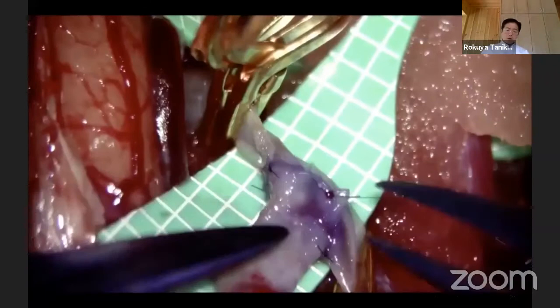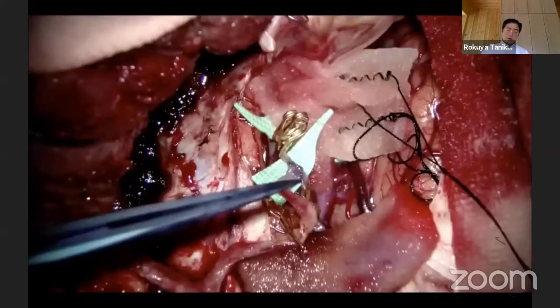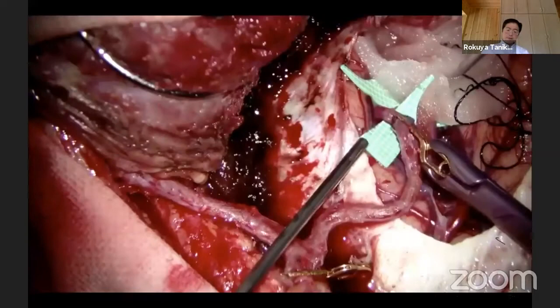After finishing one side, confirm inside whether there is needle-switch or wall-catching with the other side wall — this is very important. Then the STA-MCA bypass is finished and the bypass is opened. ICG shows good patency of the STA-MCA bypass.